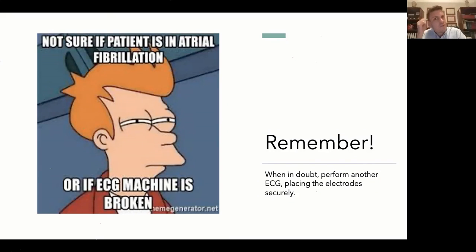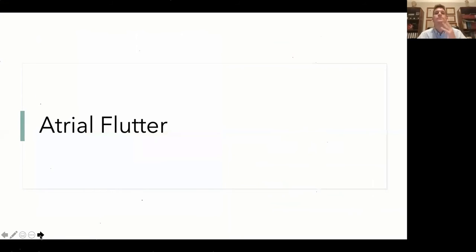And yet you'll go to the patient, they call, like, oh, the patient is fibrillating, I don't know how to make an ECG. And you're like, okay, let's just take another one and see how it goes. And then when you take the other one and you see those criteria here again, then you are sure about your diagnosis, okay? Good. So this is the first part out of the way, okay?